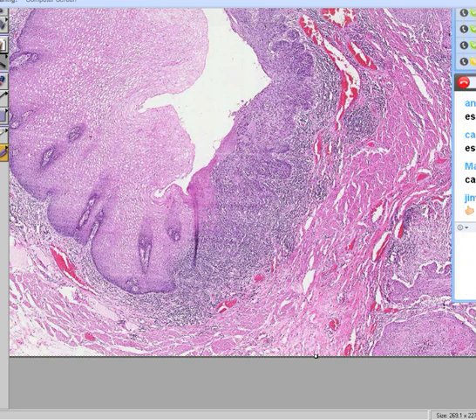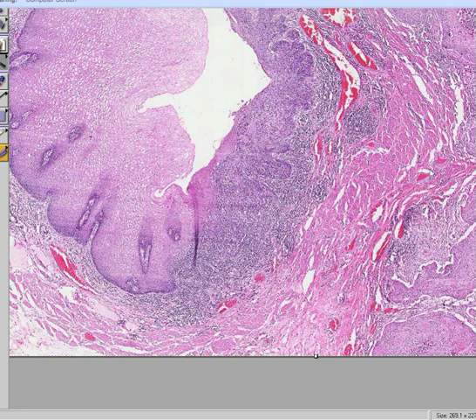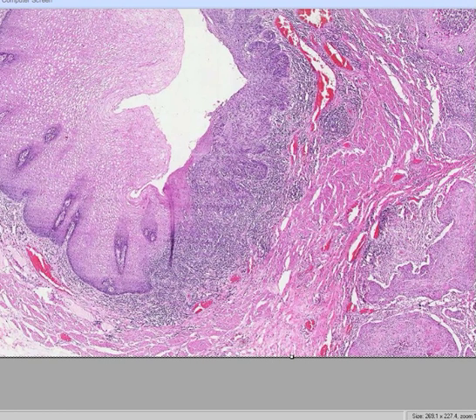And in addition, you could see that not only is everything dark, but some of these cells are actually invading through the muscle. So this is an infiltrating squamous cell carcinoma, isn't it? And what else do we want to say about it? Oh, yeah. Here's what we'll say.